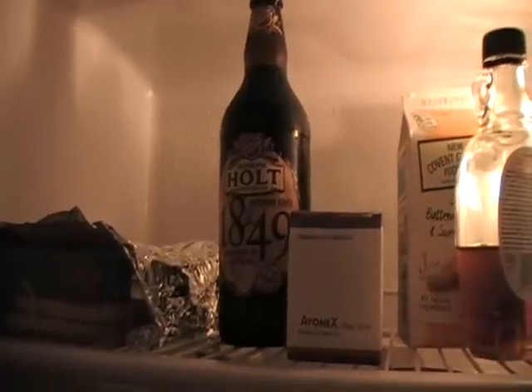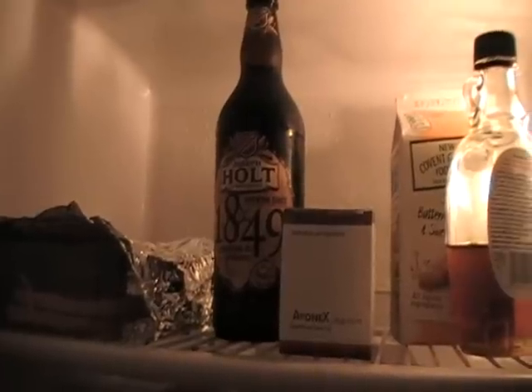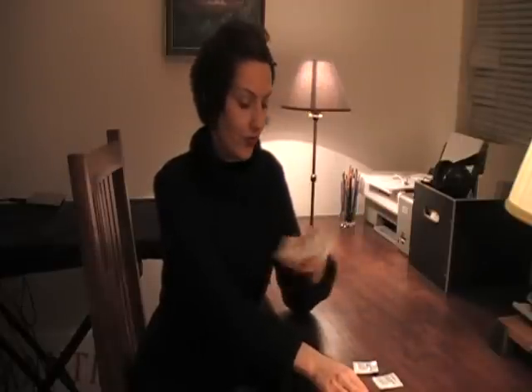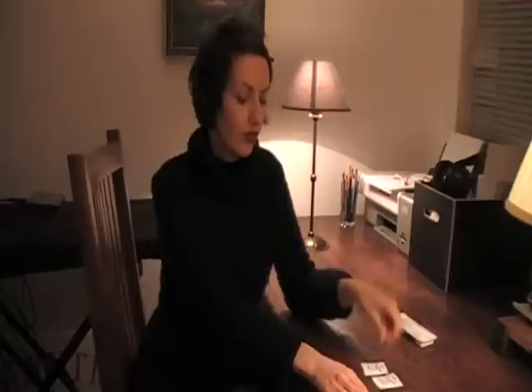An MSer's fridge — Avonex. So what you'll need to inject Avonex is one Avonex pack, alcohol swabs, or rubbing alcohol in the bottle, and one MS patient.